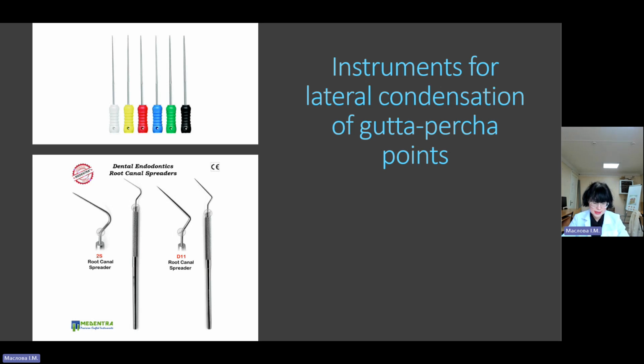Although the sealing ability and methods used to measure leakage are now considered outdated, they will be covered in this lecture as they have been employed for a number of years specifically in order to evaluate sealer performance and compare obturation methods.